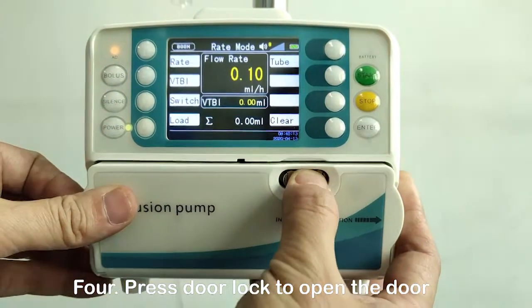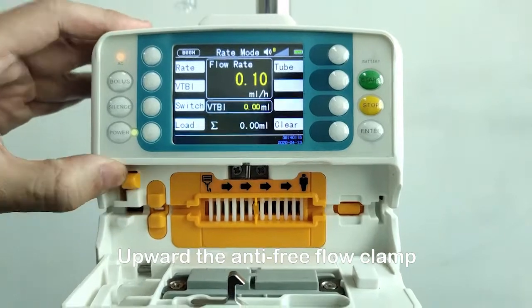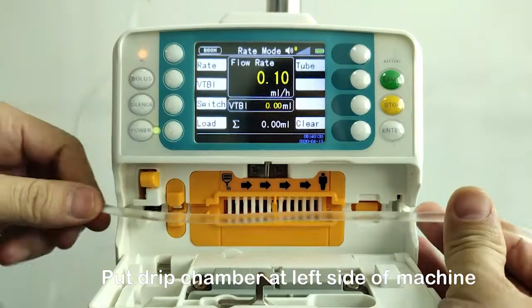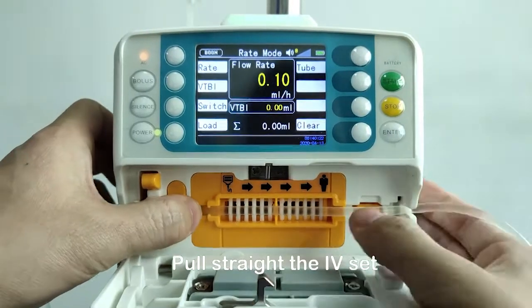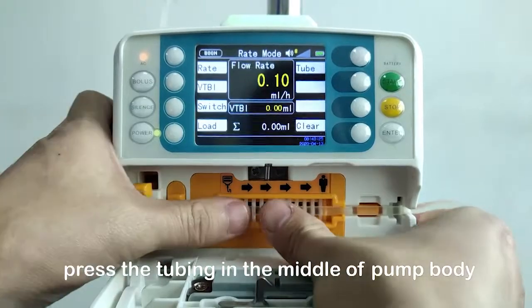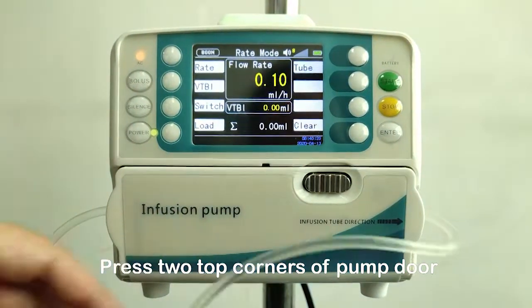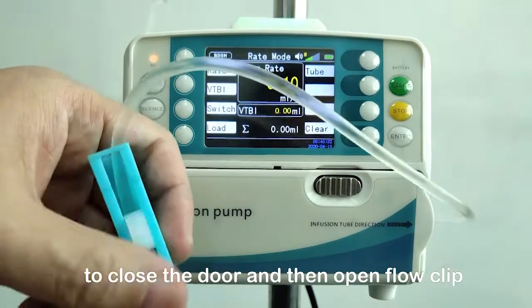Step 4: Press the door lock to open the door. Raise the anti-free flow clamp and place it at the top of the right-side plastic block. Put the drip chamber at the left side of the machine. Pull the IV set straight and install it into the groove from left to right. Press the tubing in the middle of the pump body and make it sit against the peristaltic fingers. Press the two top corners of the pump door to close it, then open the flow clip.